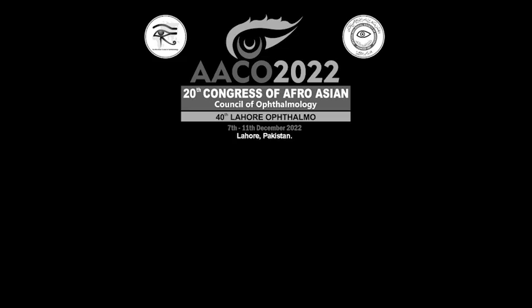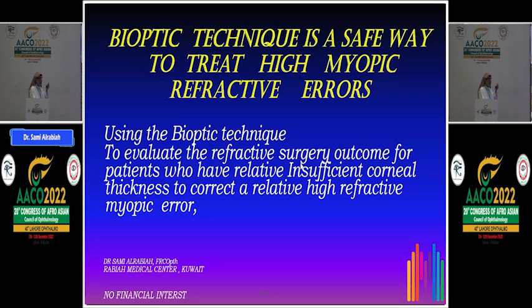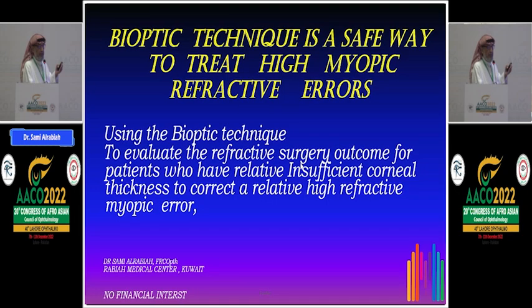Bioptic. All of us know bioptic. What is bioptic? We do bioptic. If you remember the old days when we had the ACIOL to correct high myopia, and at that time we did not have toric ACIOL. The patient is, say, minus 14 with minus 3 cylinders.